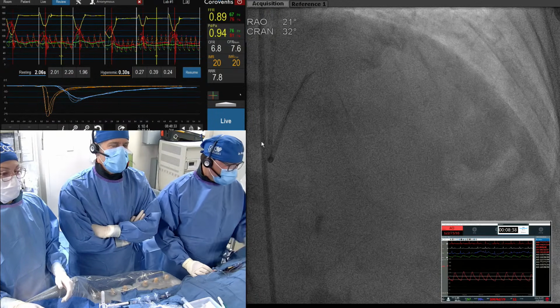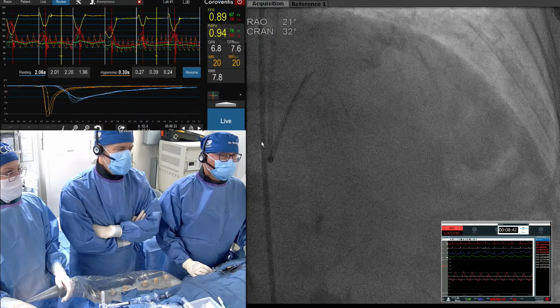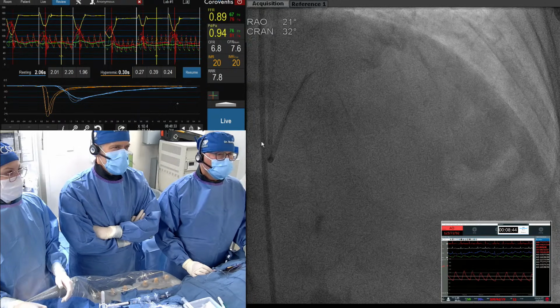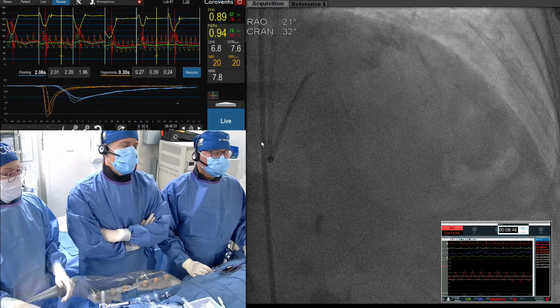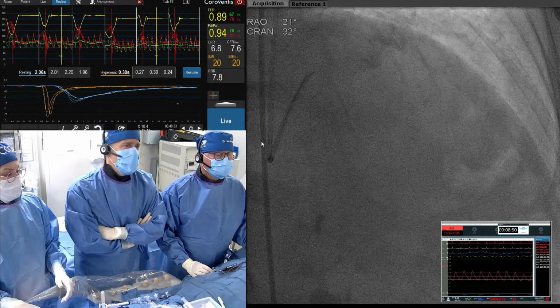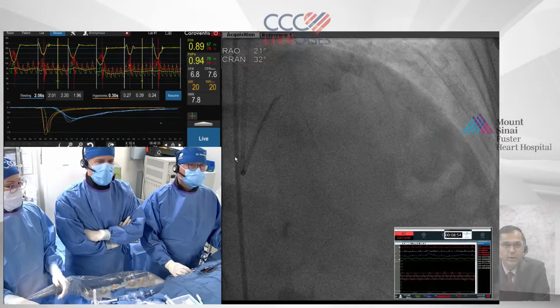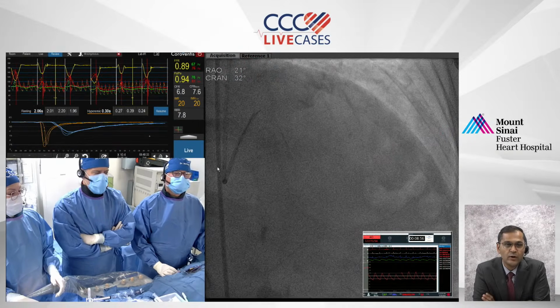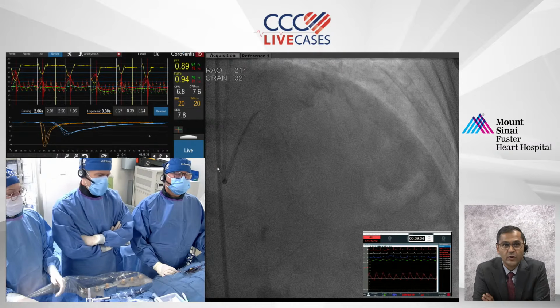Now that we have a vein, maybe doing a right heart cath and measuring good old hemodynamics. Yeah, her echo was normal. Her end diastolic pressure was 15. We do quite a bit of that where we add on a right heart cath. We'll unmask some elevated filling pressures, things like that. And then the next step for me is that I send a lot of these long COVID patients to our pulmonary hypertension group.